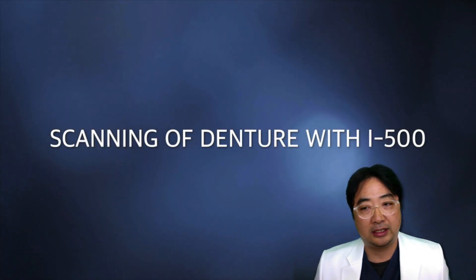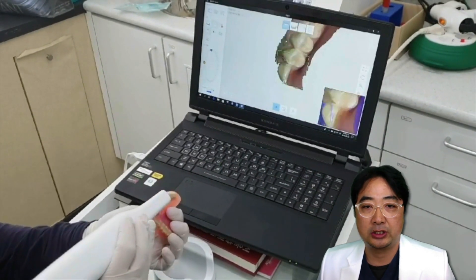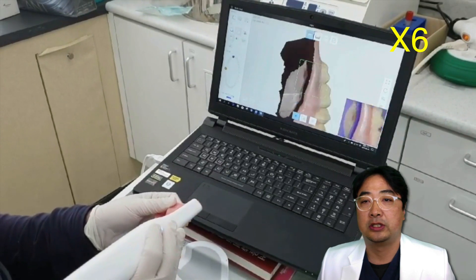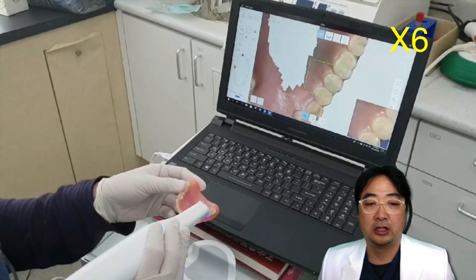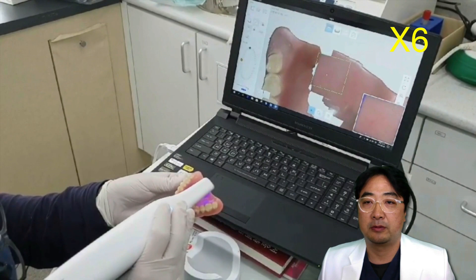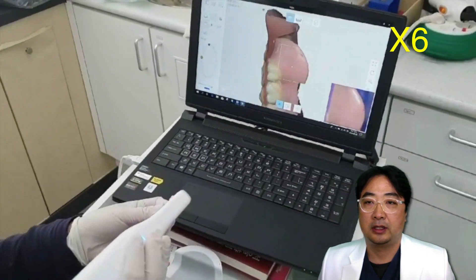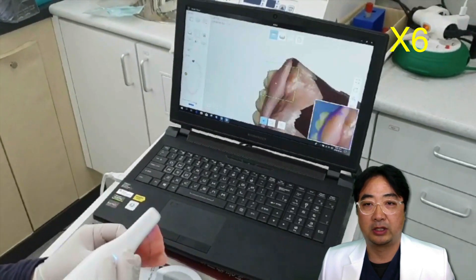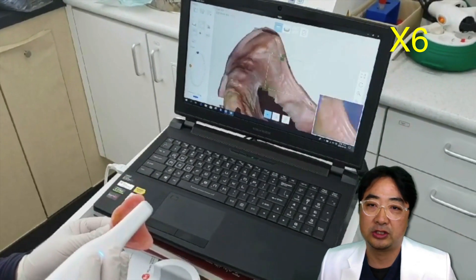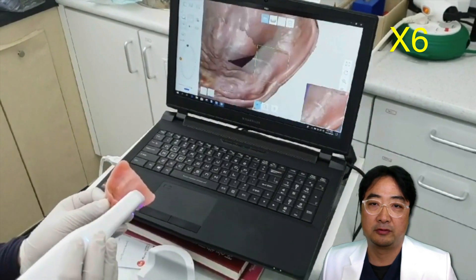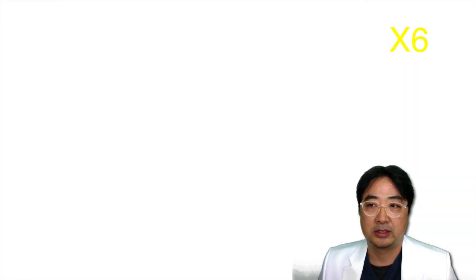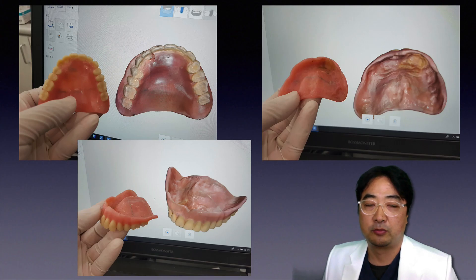The first thing I did was scanning of the existing denture instead of making a preliminary impression. I used the intraoral scanner, i-500 from Medit, a Korean company. It's not going to be too hard to duplicate — scanning a denture takes a little bit of practice, but I scanned the patient's previous denture.